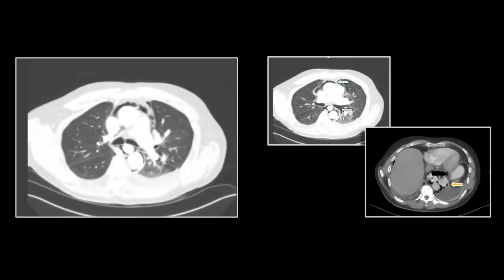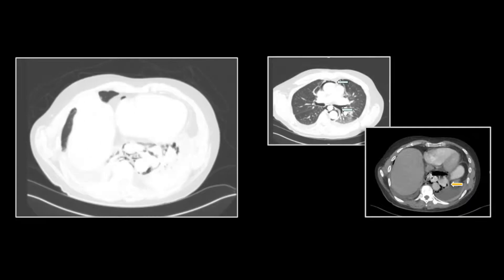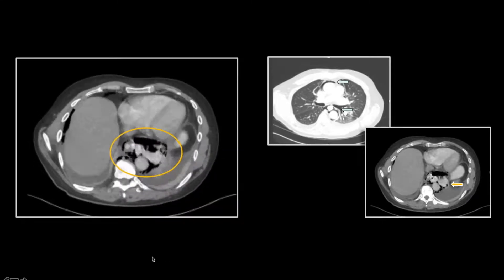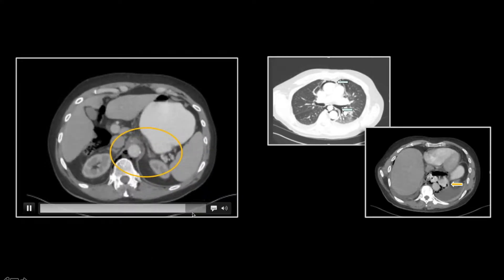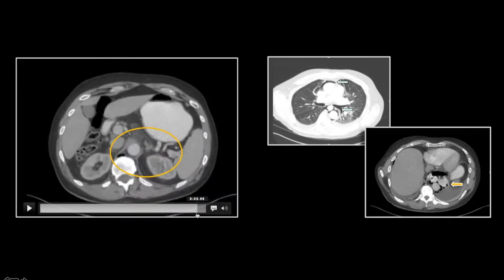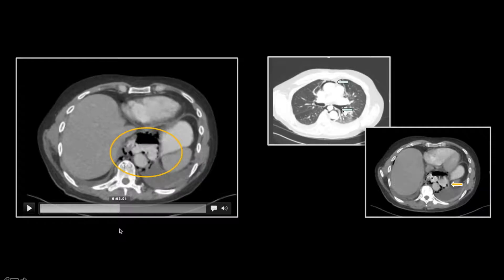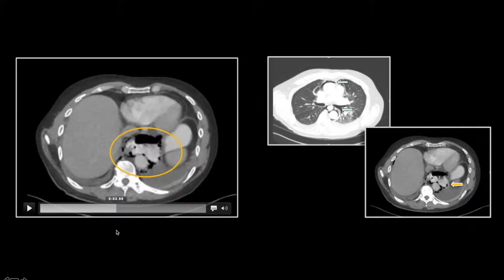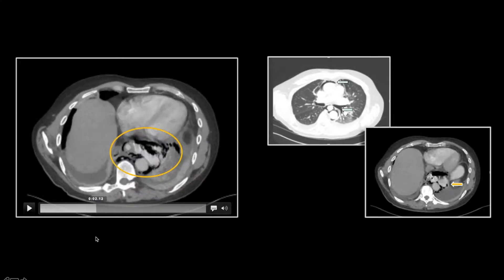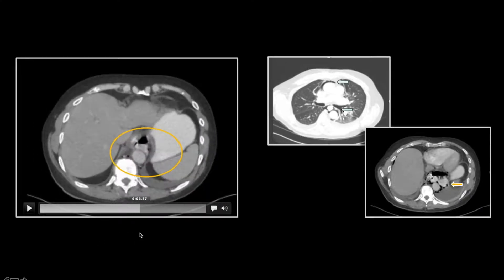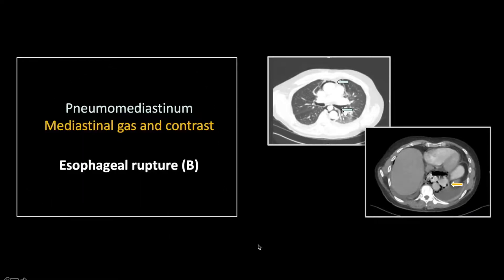This view is to help you appreciate the extent of the pneumomediastinum, and here is the collection of gas and contrast. Scrolling back up lets you appreciate the focal defect on the left lateral aspect of the distal esophagus. You don't always get to directly visualize that defect, but this case shows it quite nicely. So that is another case of traumatic esophageal rupture, this one with associated pneumomediastinum.